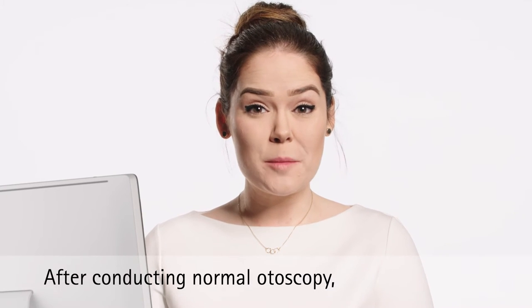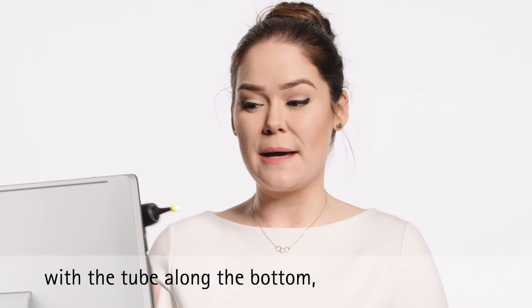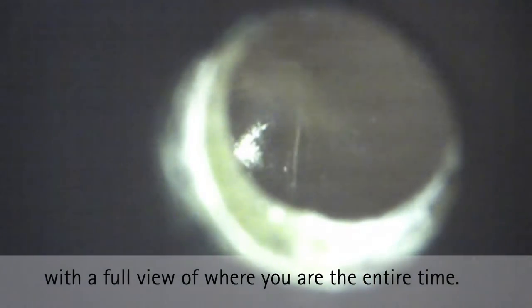After conducting normal otoscopy, you place the EasyView OdaBlock onto the specula with the tube along the bottom. Once it's on, you guide the EasyView OdaBlock all the way down the canal with a full view of where you are the entire time.